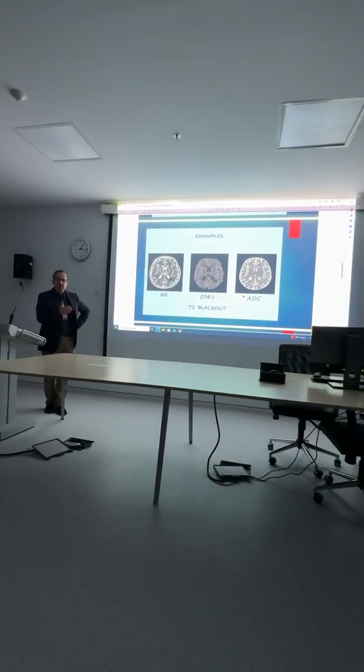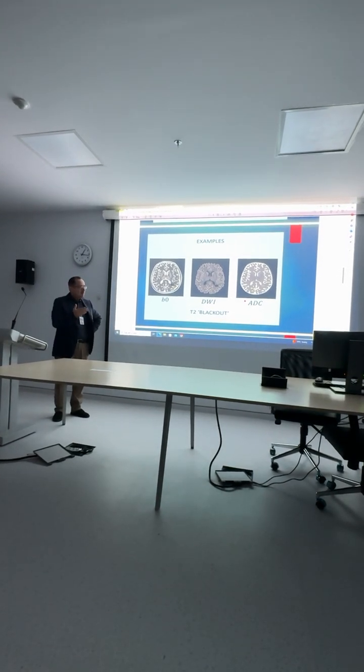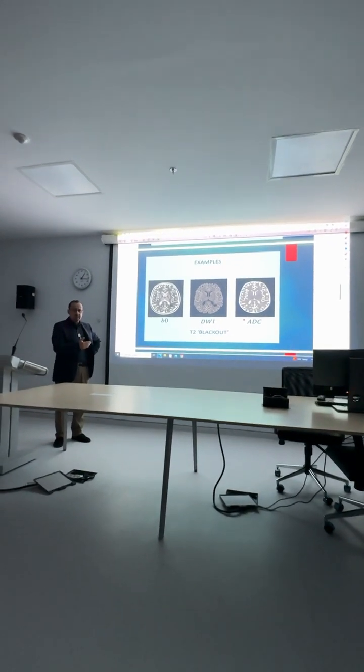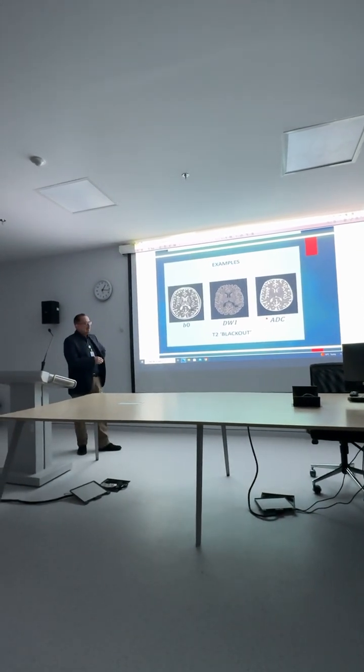These are four relatively common scenarios. The first two are very common. The second, third, and fourth scenarios are encountered in some cases, and it is better to be familiar with their presentation and explanation.